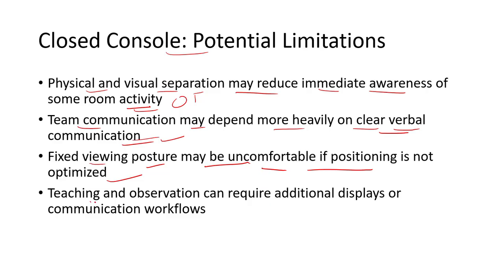Teaching and observation can require an additional display or workflow for communication. In a closed console, only two eyepieces are there, and the surgeon has a fixed, optimized head and eye coordination.